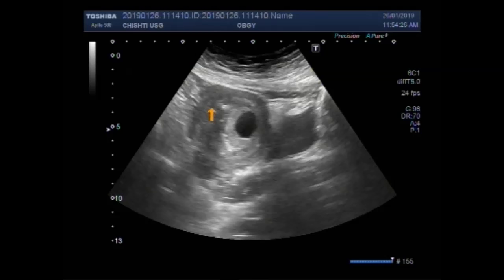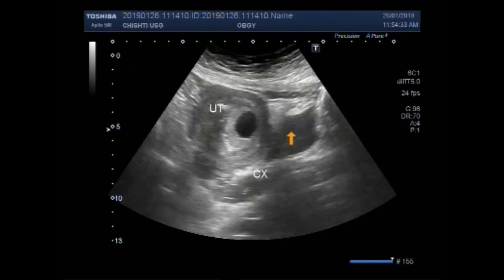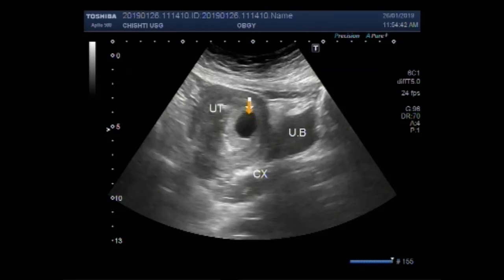You can see this is the uterus, this one is the cervix, and this is the urinary bladder. Now this is the gestational sac in which no fetal pole is visible.